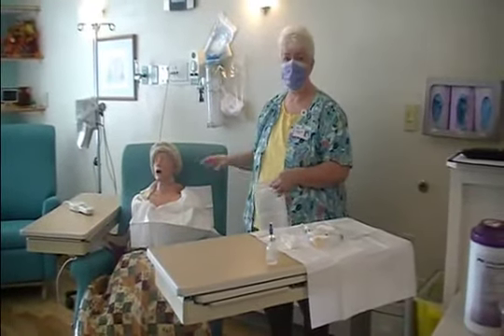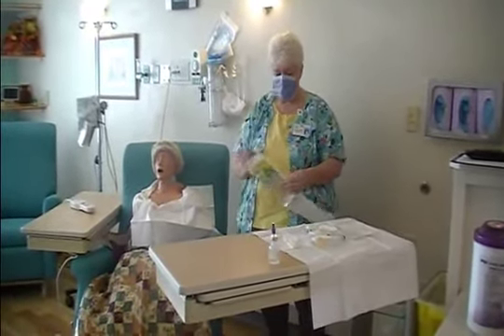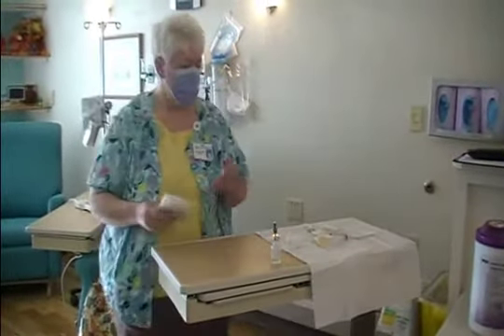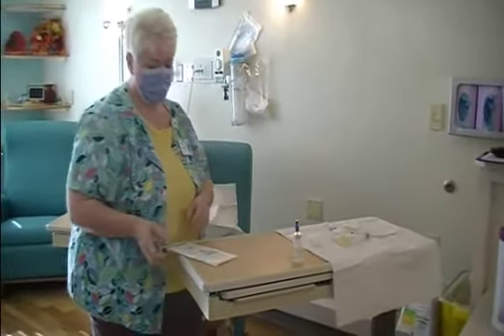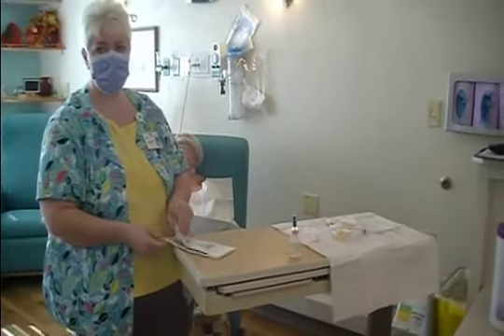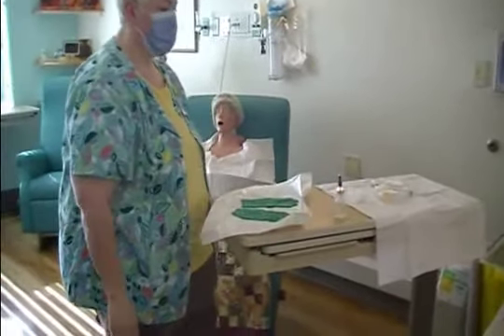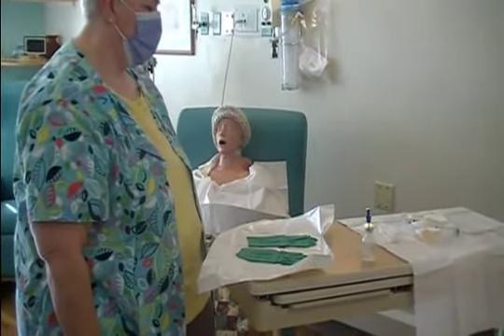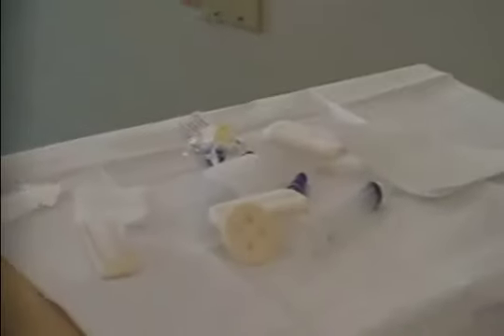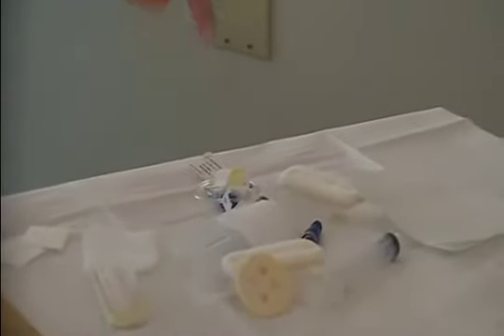In the meantime, hopefully that lidocaine is working and this patient is getting number. This is my sterile field — I opened everything away from me onto the sterile field. I tried to make sure I thought of everything I needed before I started, so that I don't have to try to remember things after I get my sterile gloves on, especially if I'm in the room by myself. I've got my syringes, my chloroprep swabs, a dressing, gauze if I need it, and an end cap for my needle.